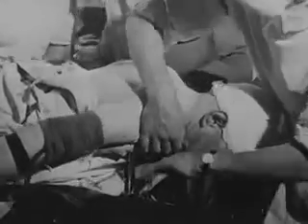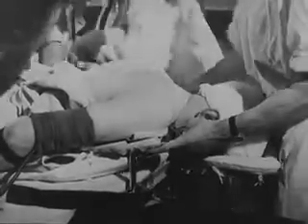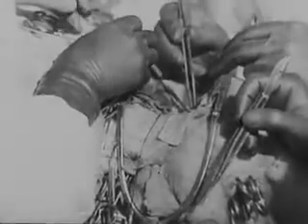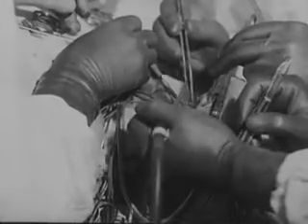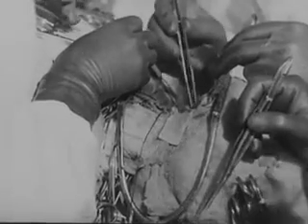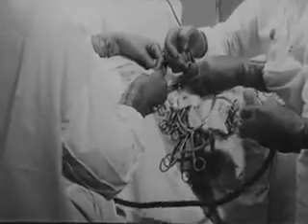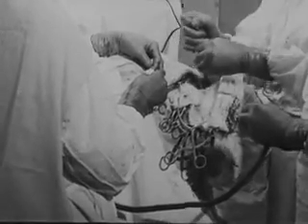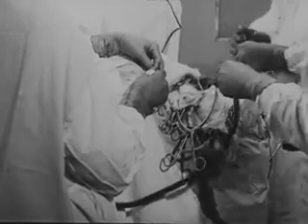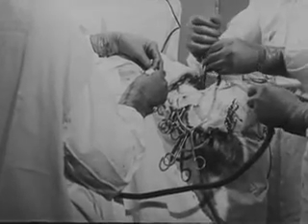Here is a patient being placed in the prone position for a craniotomy. Notice that the anesthetist does not lose his hold on the tube while the patient is being moved. Also note that endotracheal anesthesia is of the greatest advantage to the surgeon in helping him to maintain strict asepsis. Not only has the method proved a benefit to the patient and the anesthetist in the protection it affords to the airway, it has considerably increased the scope of surgery in the region of the head and neck.